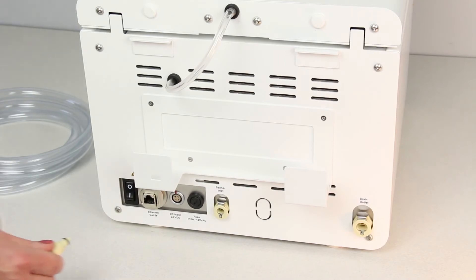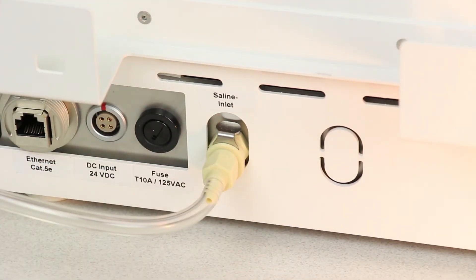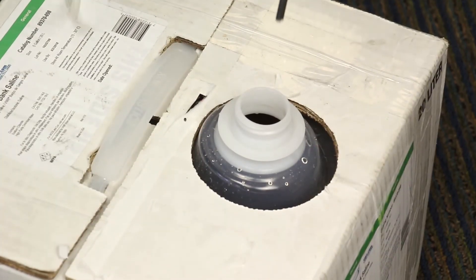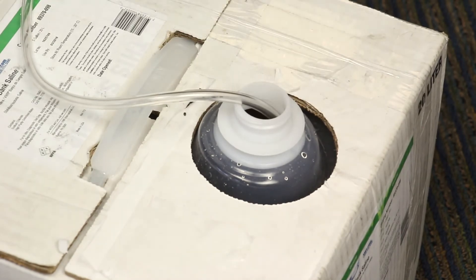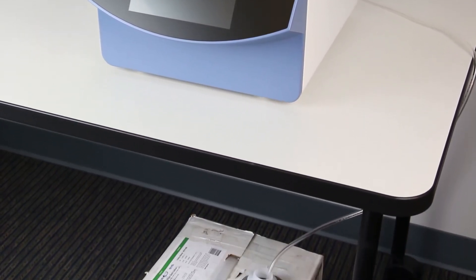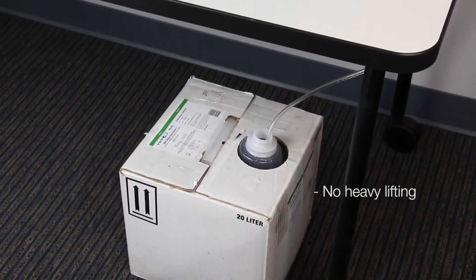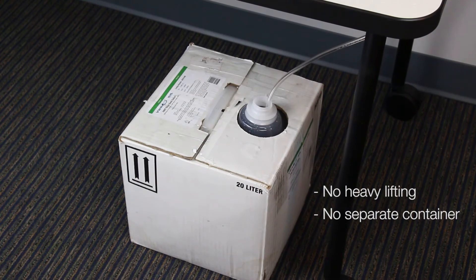Next, we'll connect the tubing. Place the saline tube into inlet 1, and then place the end of the tube into a saline container. The saline supply can be placed above or below the Ultra CW2. Placing it below the unit eliminates heavy lifting. Also, the saline is directly connected to the Ultra CW2 — there is no need to use a secondary tank. This eliminates the need to pour saline from one container into another.